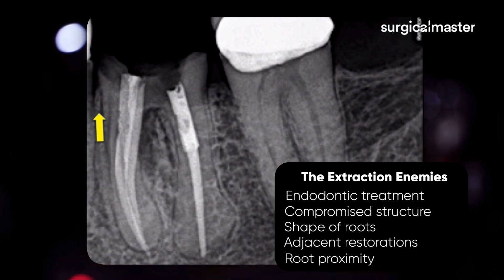So these are the 5 challenges that I see in extracting this tooth. And you can tell how much information I can get from only one periapical radiograph. It's amazing to see that many times we're missing all the important details and just rushing to do the procedure, while we could have predicted all these challenges and could have prepared for them.